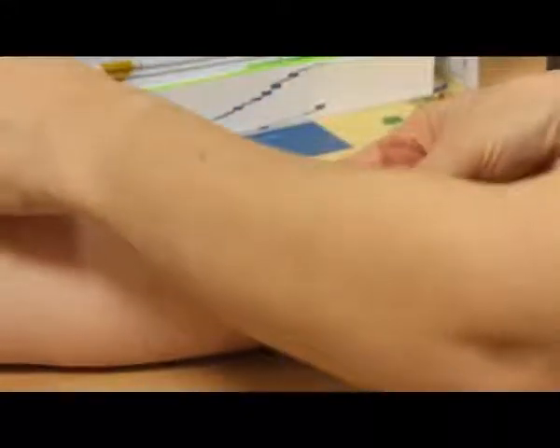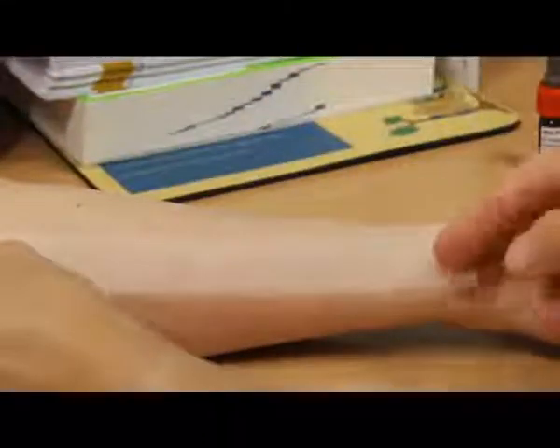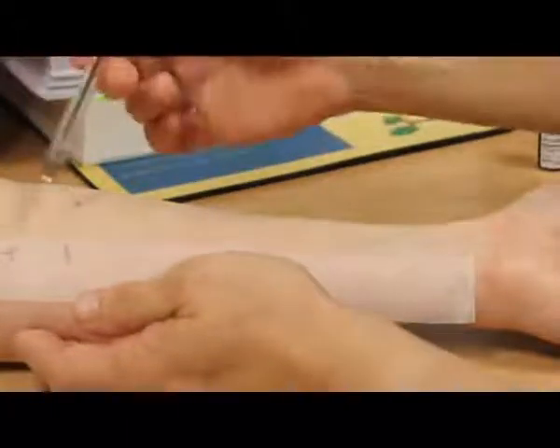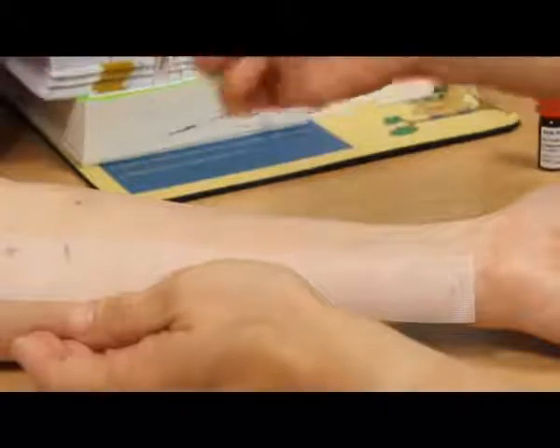So first of all, I'm just going to pop some tape on your arm. This just saves me drawing on your arm, it just makes it easier, and you don't go out looking like you've been tattooed. And then we're just going to put a plus and a minus. So these are for the test. This one will tell us if the test is working.